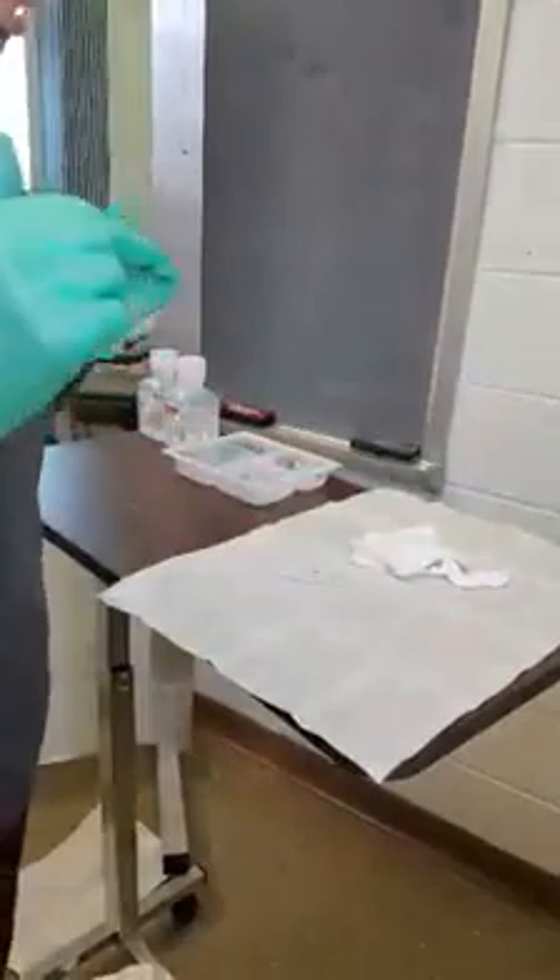And then rinse the inner cannula with the normal saline solution. She'll replace the inner cannula, securing and locking it in place.